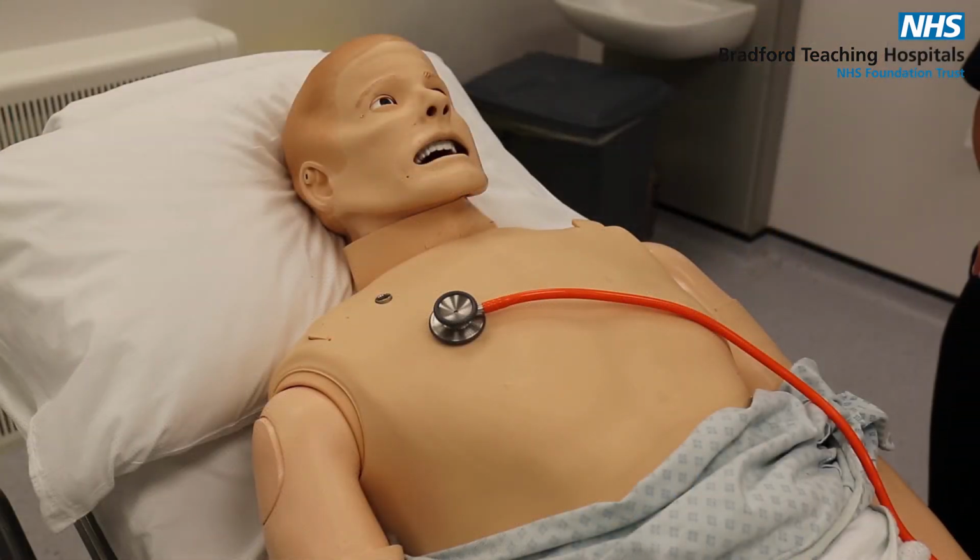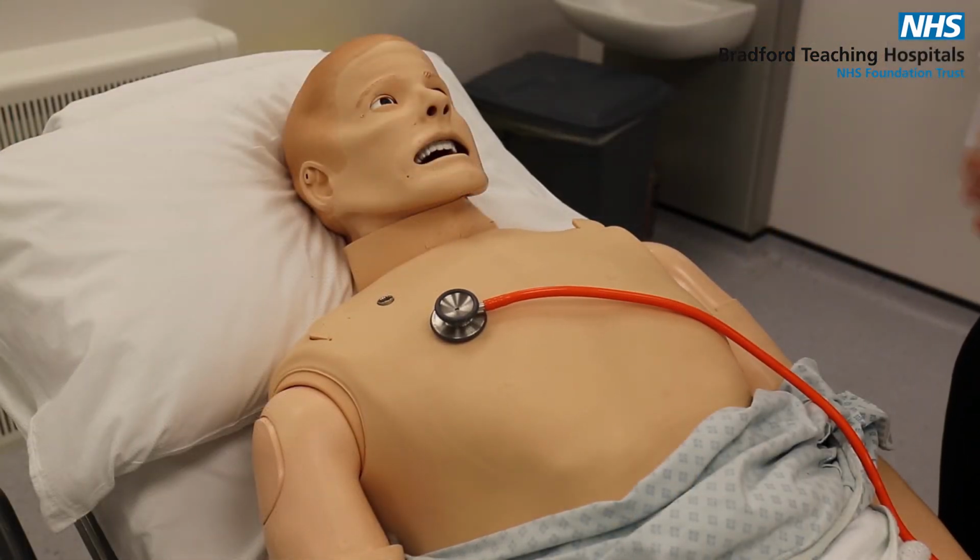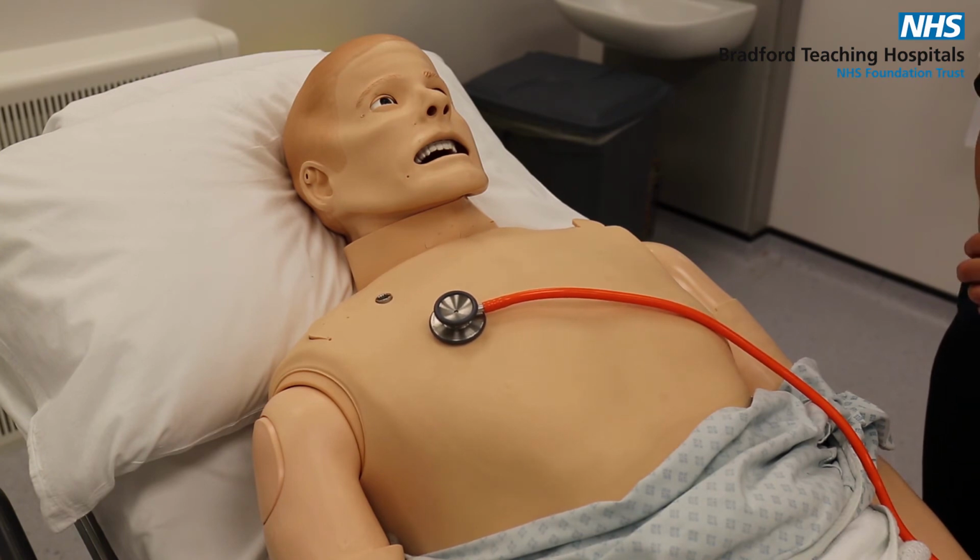So Simman has heart and chest sounds, so it's really important as part of your patient assessment that you have a listen to the sounds.